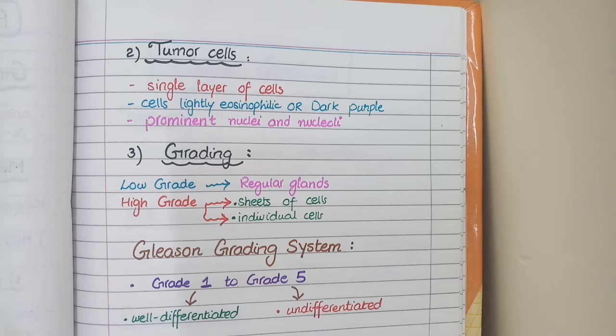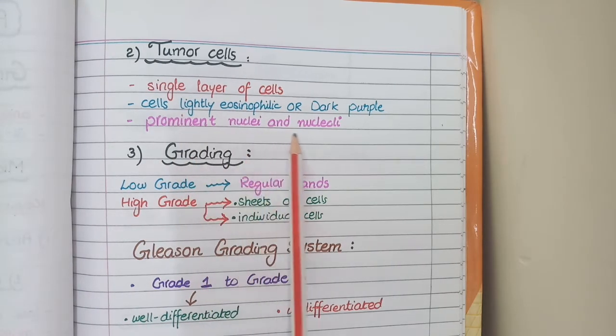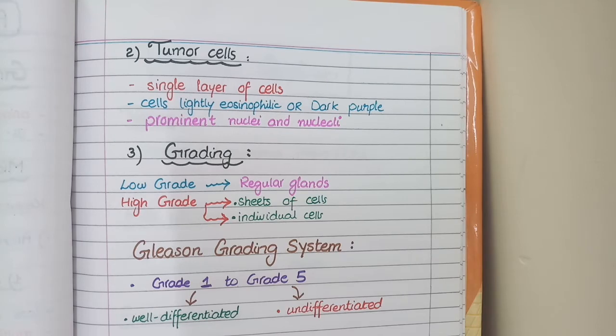Thirdly, in prostate carcinoma, the tumor cells have prominent nuclei and nucleoli. You know that in carcinoma, the cells are dividing very rapidly. So as a result, you see prominent nuclei and nucleoli.